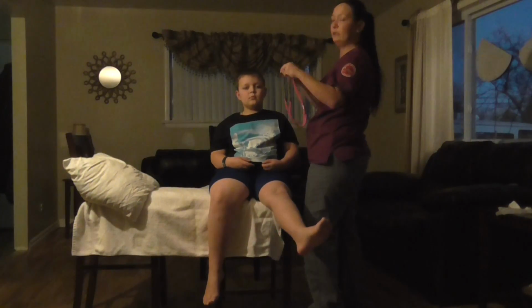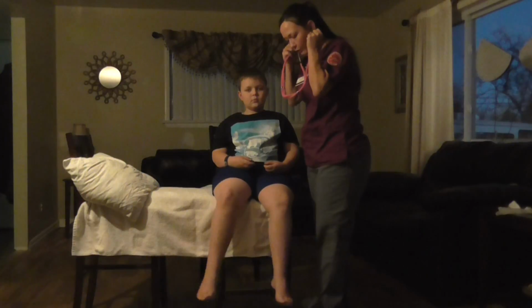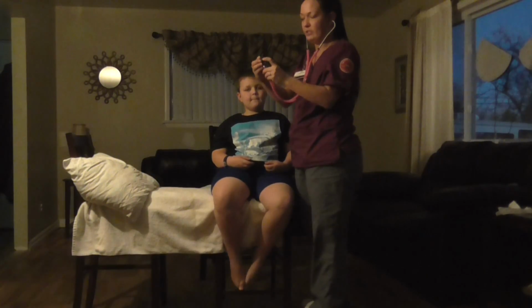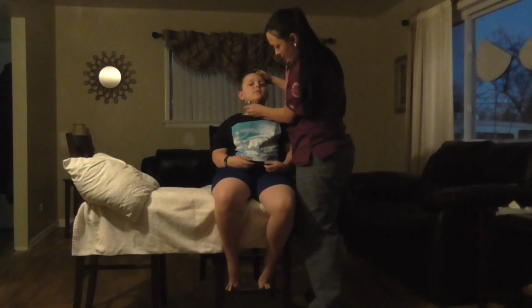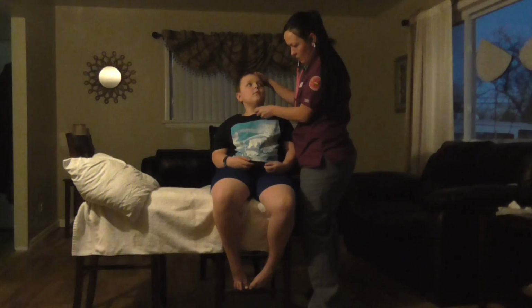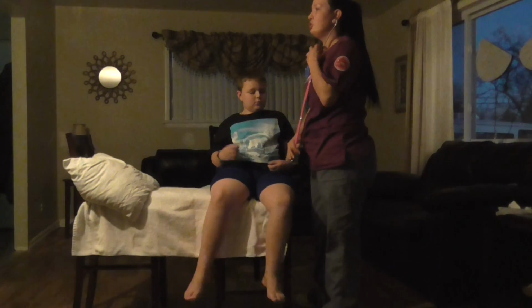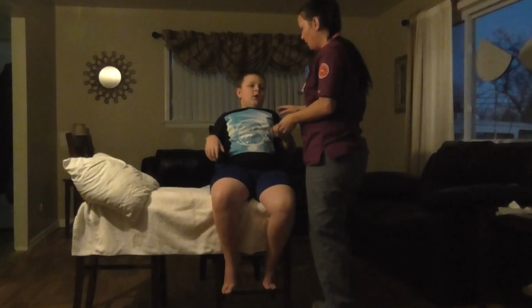This is also where you would listen for a bruit, which is like a swish on the carotid artery, and you would use the bell of your stethoscope. You would listen to the upper, middle, and lower third of the neck on both sides. And during the bruit check, I would have the patient hold their breath.